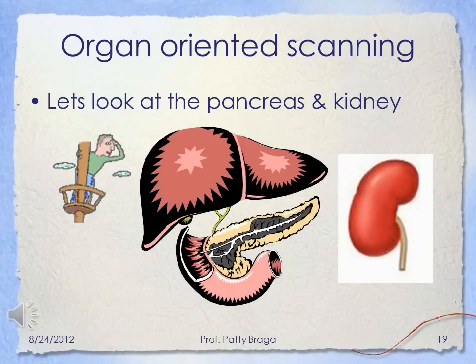The kidney, if you look at that picture on the right, the top part or the superior part of the kidney is actually angled in a little bit more than the lower part or the inferior pole. One of the things that we do that's important for our kidney is to measure the size. It's an indicator for medical renal disease.